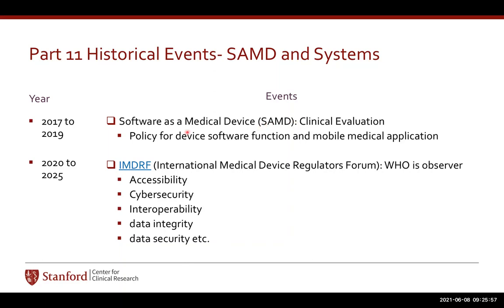So what is software as a medical device? They are stand-alone systems. They are not connected to any device, because most of the people over here are used to a device that has hardware as well as software. But with software as a medical device, they claim that, well, this is software and that is my medical device. I will come back to that later with some examples.